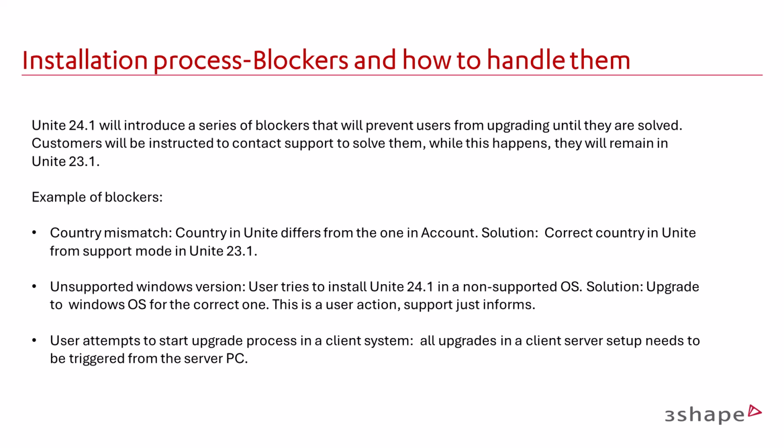Unsupported Windows version. If a user attempts to install Unite 24.1 on a non-supported operating system, they will be blocked. The solution is for the user to upgrade to the correct Windows version. Please inform customers about the supported operating systems for Unite 24.1.